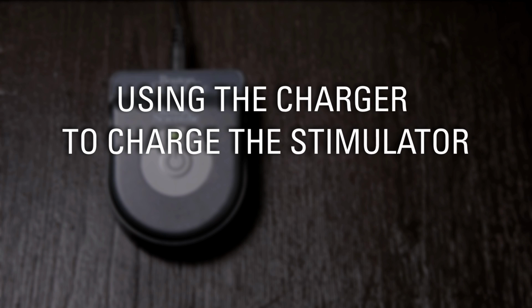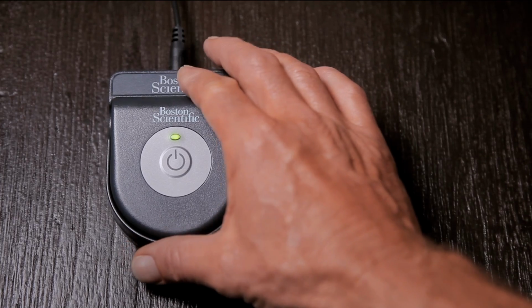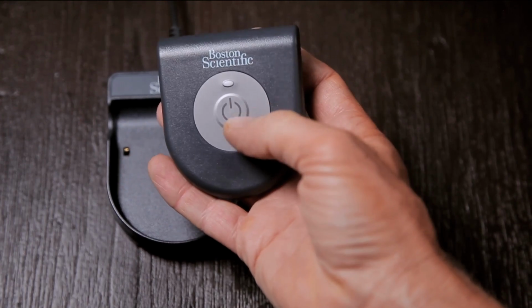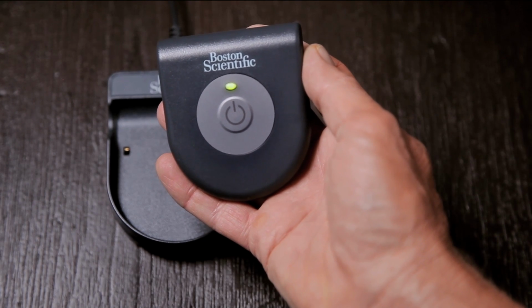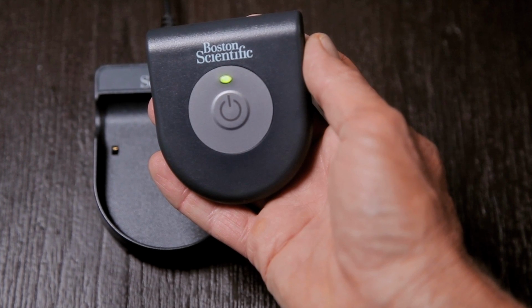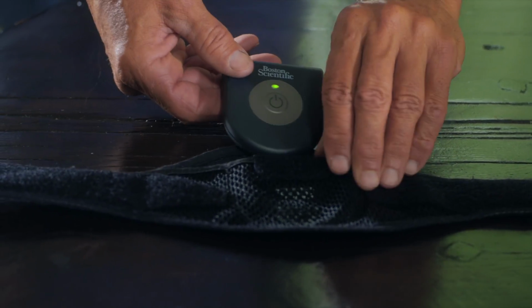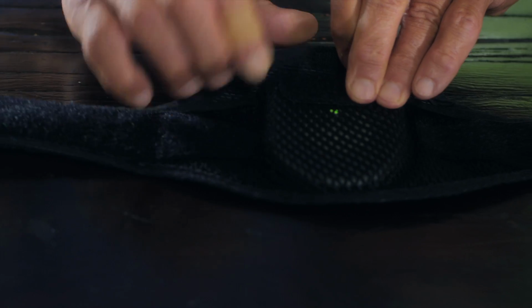Using the charger to charge the stimulator. When the indicator light is green, remove the charger from the base station and press the power button. The indicator light comes on again, and the charger begins beeping steadily to signal that it's searching for the stimulator. Place the charger into the pouch of the charger belt so that you can see the power button through the mesh fabric.